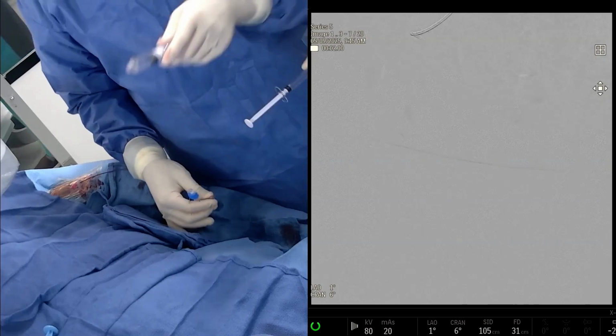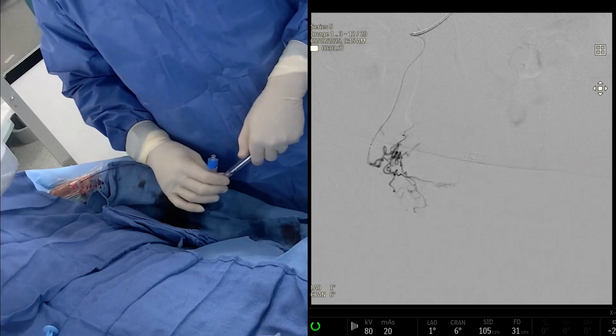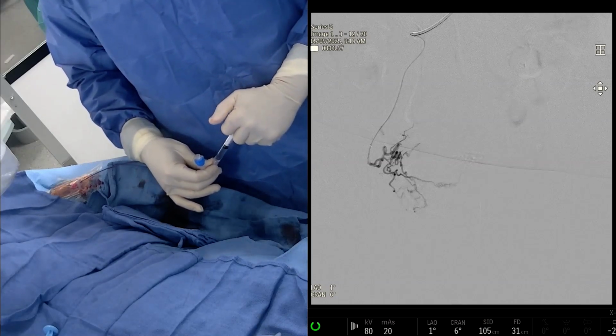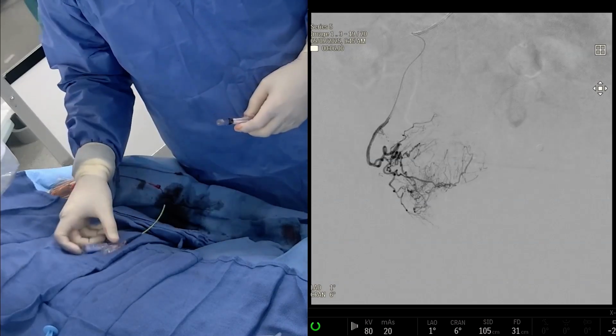If they feel it in their rectum, we know we're probably feeding some rectal branches, so it's a nice way to get a sense of where the arteries are feeding and what you're dealing with. But this is very obviously a prostate artery. You can let that run play a little bit, Viv. See if we can play that again. Aaron, if you don't mind. Yeah, go ahead. Sorry.